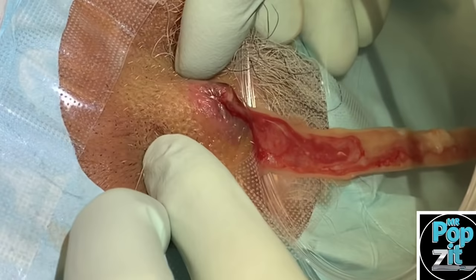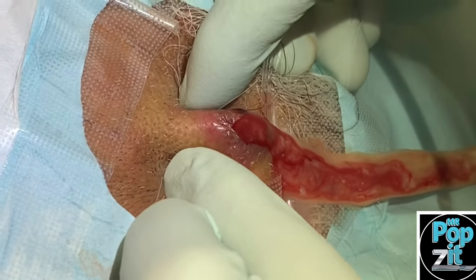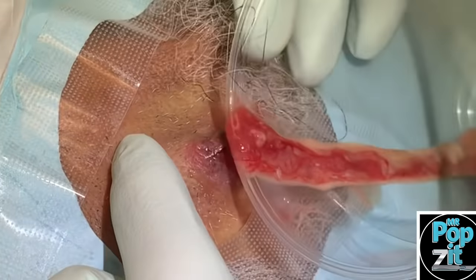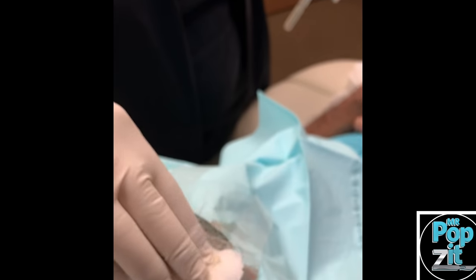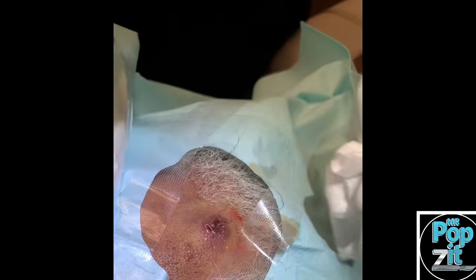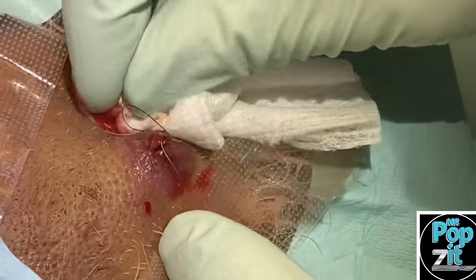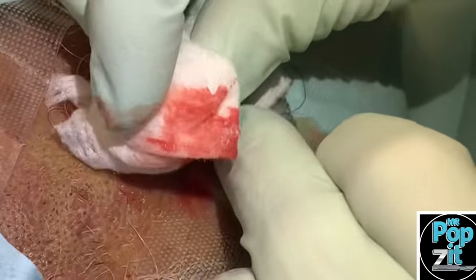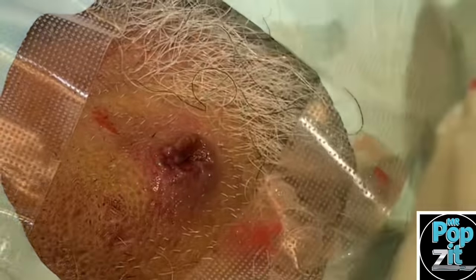It's just an inflamed cyst — so common. You can see down here that's actually quite a bit of cyst particle right there, a little bit of blood, inflammation, and what they call purulent discharge. And then let's do a little culture.